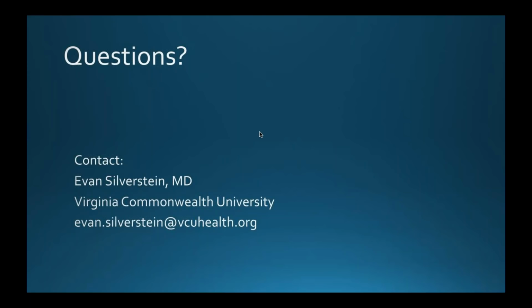And so when you get that error message, just think about what in the room might be distracting the child, so that they're not looking at the device. Or if the pupils are just too small, then consider dimming the room lights. And I'm pretty sure you can do it in a completely dark room as well, because it uses infrared technology, so you don't even need much light in the room to get their measurement, and you can follow the eyes on the screen pretty easily.